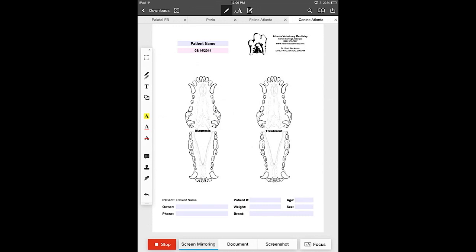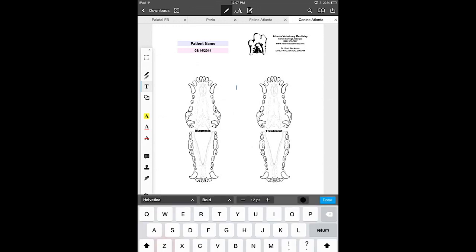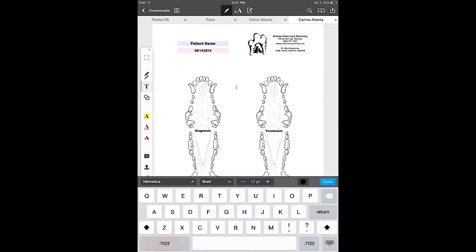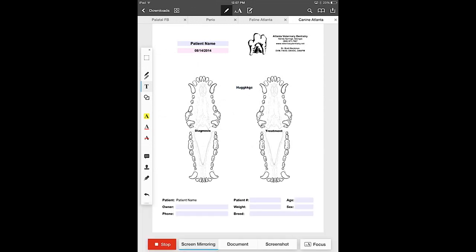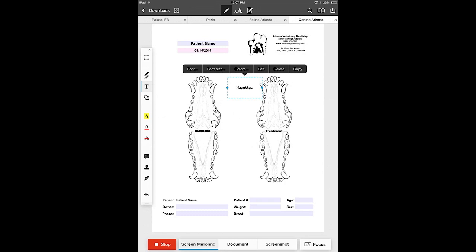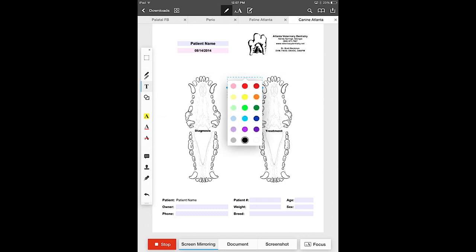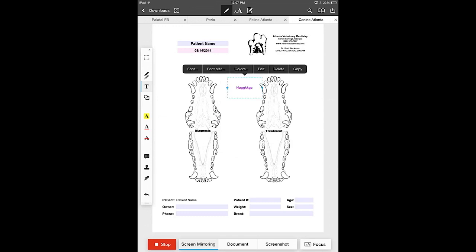You go down below the pens and you'll see the T for text. You hit the text, you hit anywhere on the chart and it brings up your type pad and you can type as you will and create done. Then tap on that itself and you can edit it, you can delete it, you can copy that, you can change the font size, you can change the colors, you can do quite a few things with that. So let's delete that.